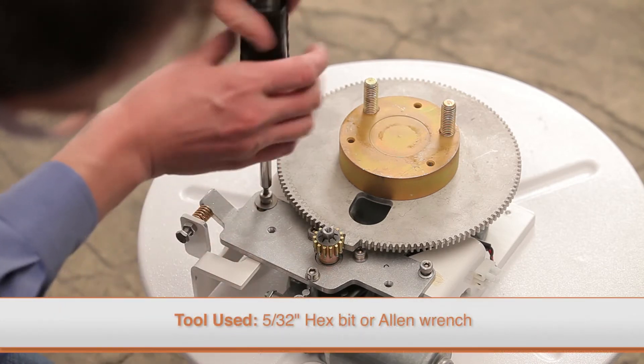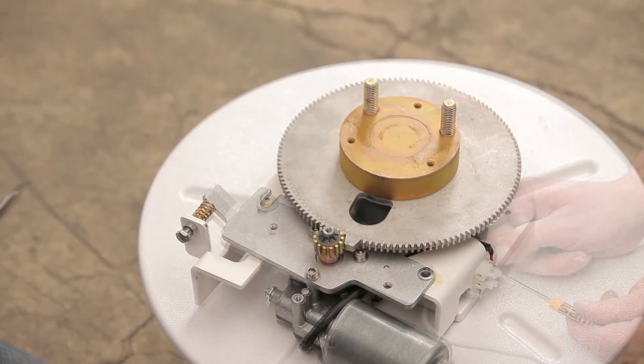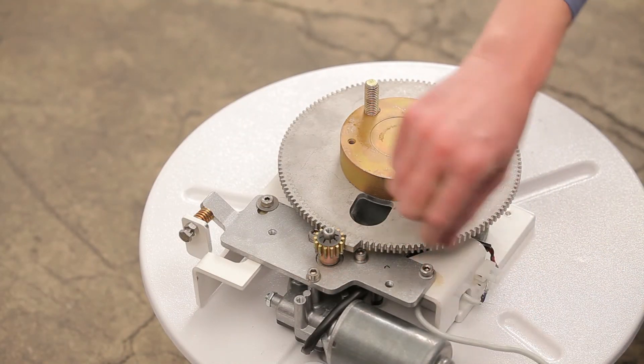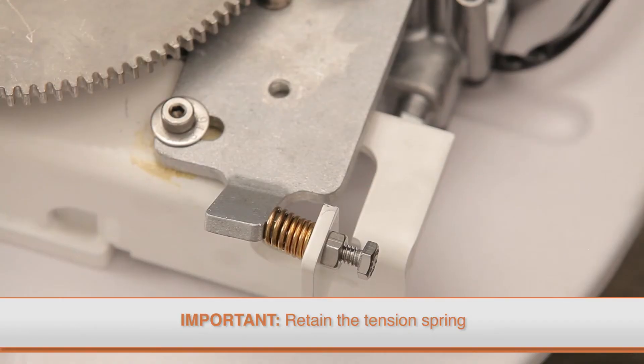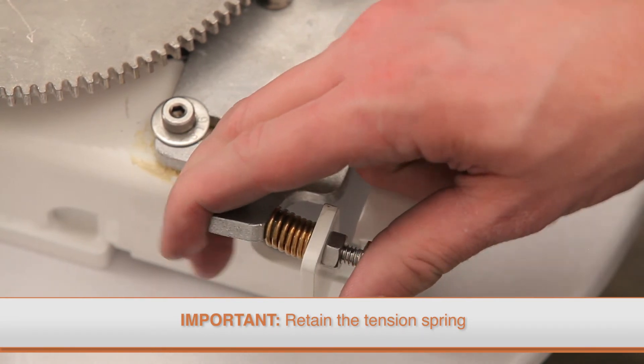Securely tighten the terminal screws. To replace the motor assembly, remove the two mounting screws using a hex bit driver or Allen wrench. Make sure to loosen the screws on the terminal block that secure the motor cord and remove the cord from the block before removing the motor assembly.